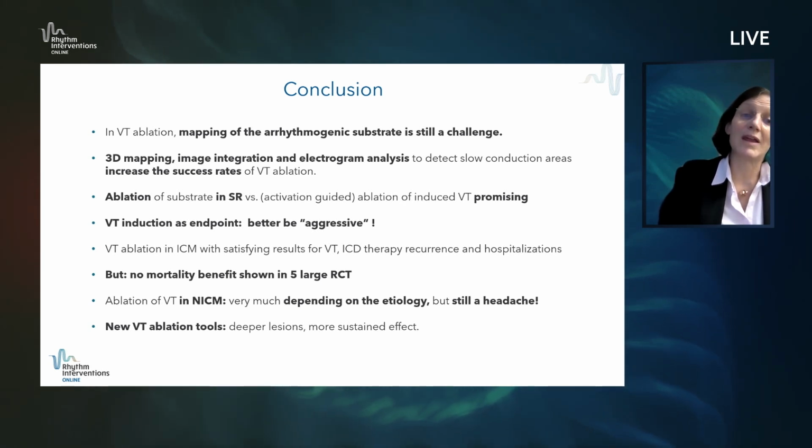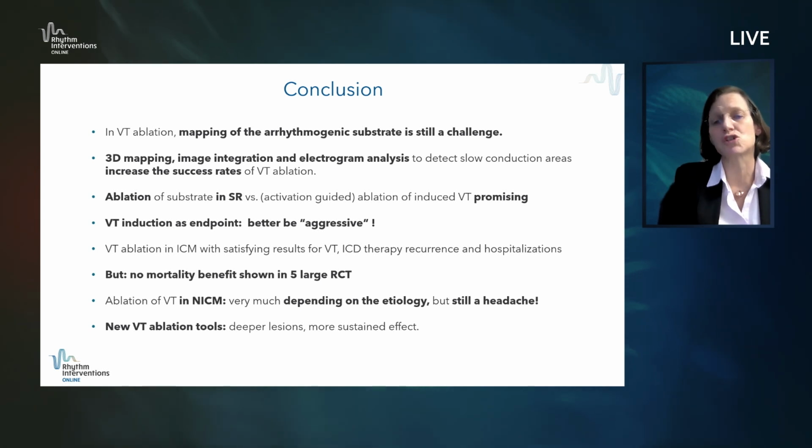And for the new ablation tools, I think deeper lesions, more sustained effect. We have some things in the toolbox here, bipolar ablation, as I showed you, or the needle ablation, but that's something to come. And I think we can there even increase the success rate of the VT ablations. So thank you for your attention.